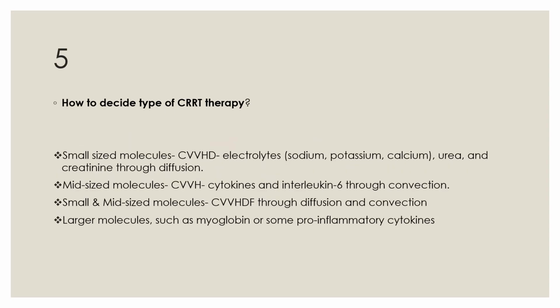How to decide type of CRRT therapy? It depends on your goals of therapy and underlying disease condition in addition to expertise and resources available. CVVHD and CVVHDF effectively clears small molecules like electrolytes, sodium, potassium, calcium, urea and creatinine through diffusion. CVVH and CVVHDF are effective for removing middle-sized molecules like cytokines and interleukin 6.